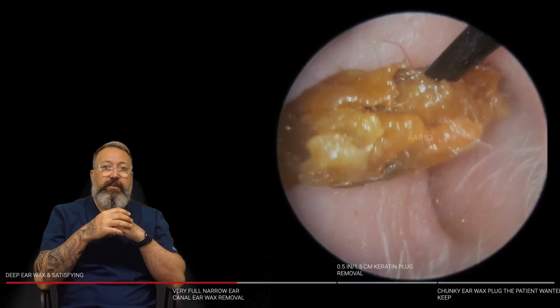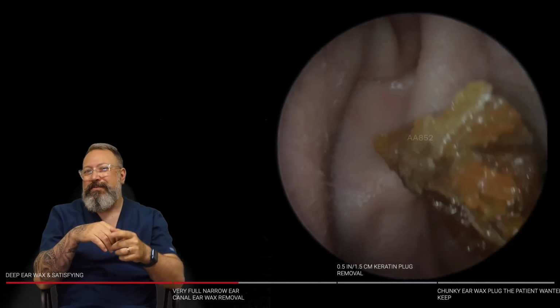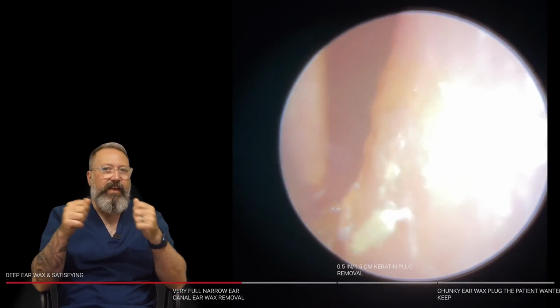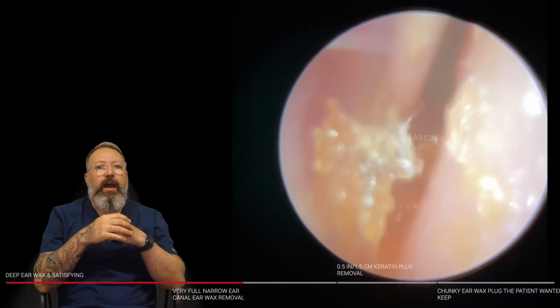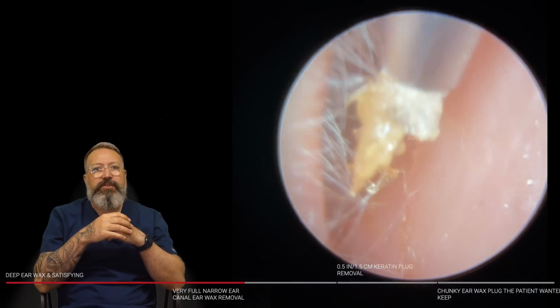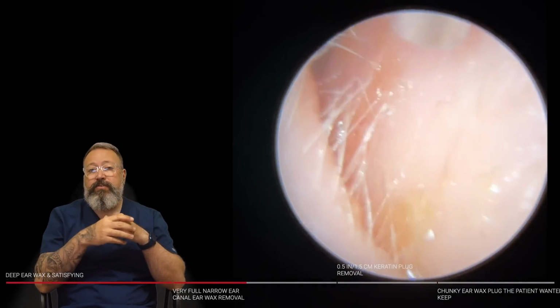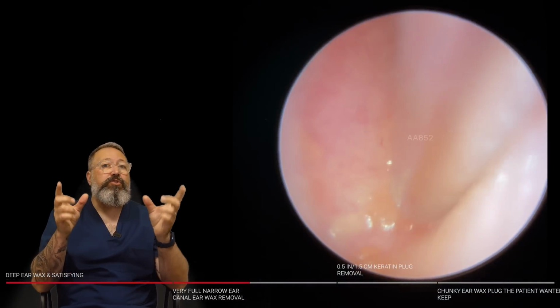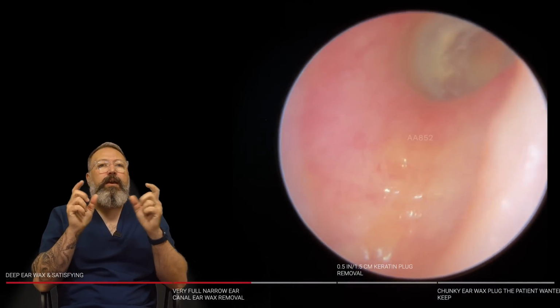Let's lift that up so you can take a look at that. I'm trying to remember to do this, guys. I keep forgetting sometimes. I get so carried away in getting the wax out that I just forget to hold it there so you can see it coming out. We're just lifting these bottom sections, just a bit of tidying up. This is actually the fine end on here now rather than the standard size on the tube.